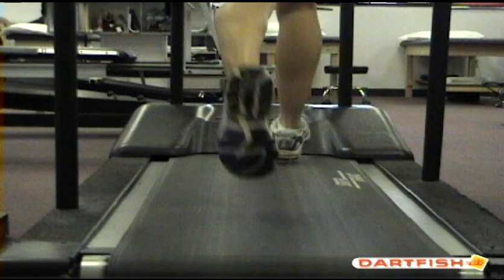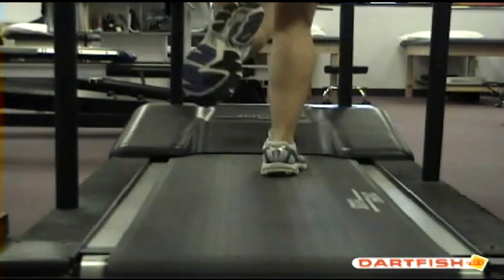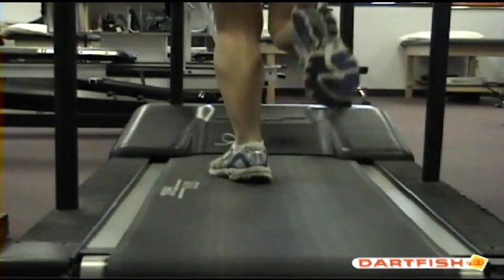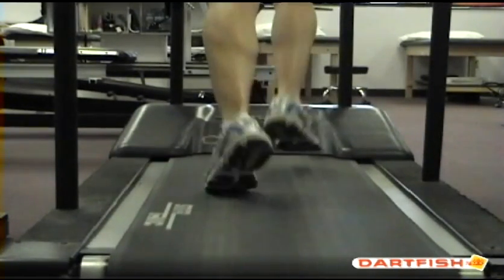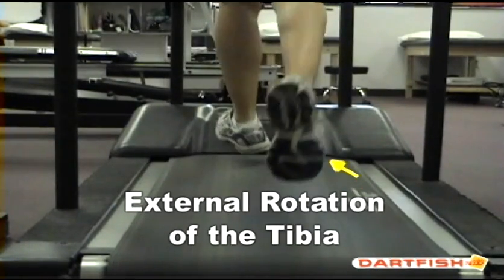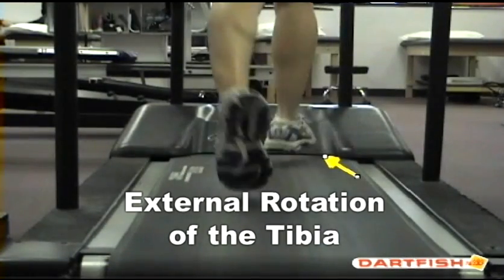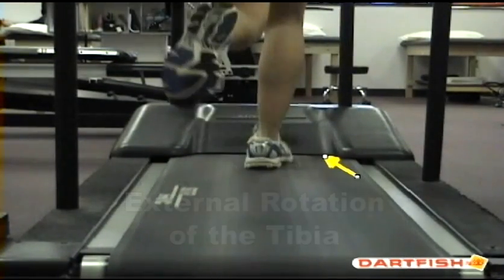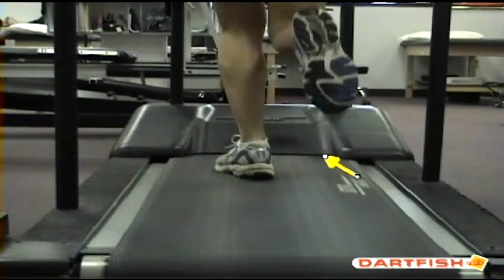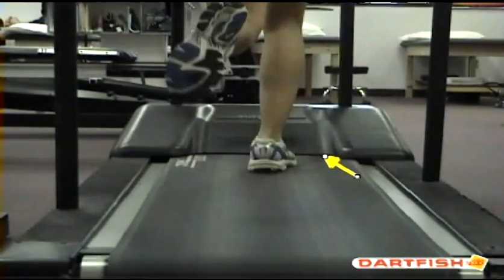Video 2 is an example of how we can use Dartfish again from the rear view, but this time looking at something else. This patient tends to externally rotate the tibia during stance phase, as seen by the arrow here. This extra rotation may be due to underlying tightness in the calf muscles or hips, or perhaps the patient has weakness.